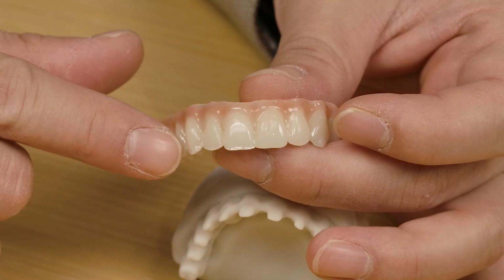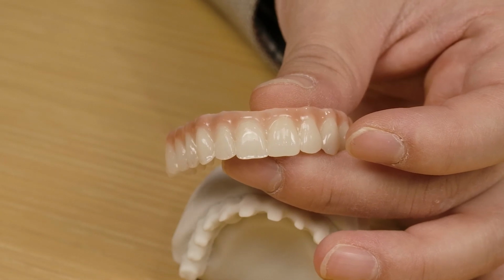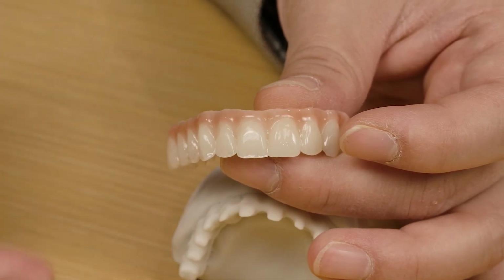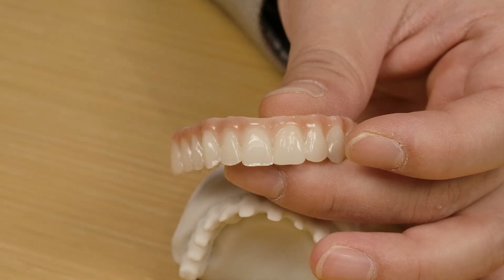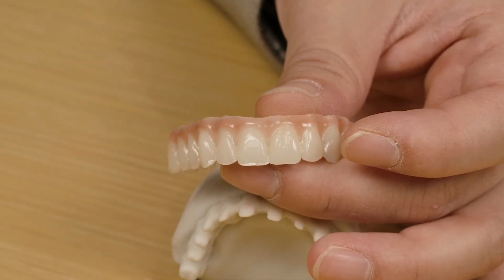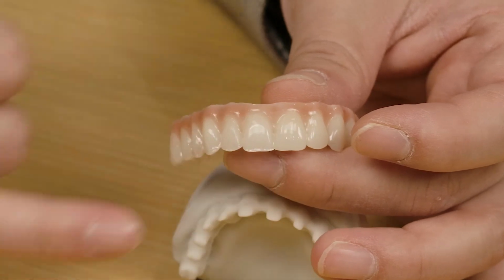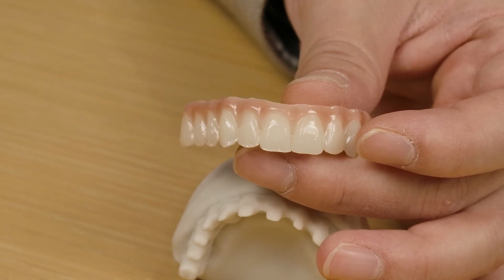Once my internal staining is done, then I'm now ready to do actual ceramic buildup. So at that point, I modify a little bit more of a pink porcelain, and mainly on a tooth portion, I use enamel such as an E2 porcelain, and I put some Super Luster LT or LT1 or LT0 porcelain, and maybe towards the edge I use a little bit of creamy enamel to create a little bit more of a halo look. Towards the edge, I apply a little bit of creamy enamel to mimic the halo look.